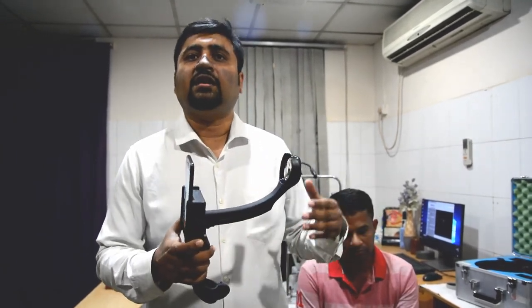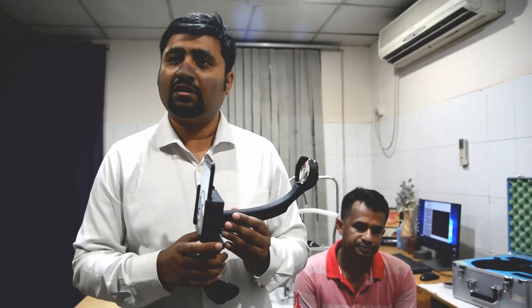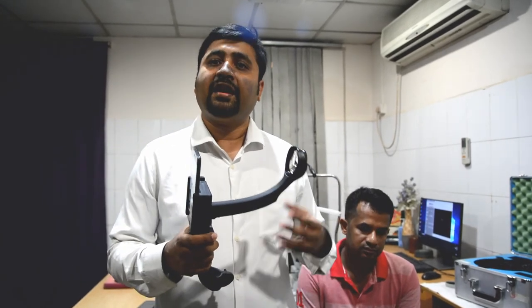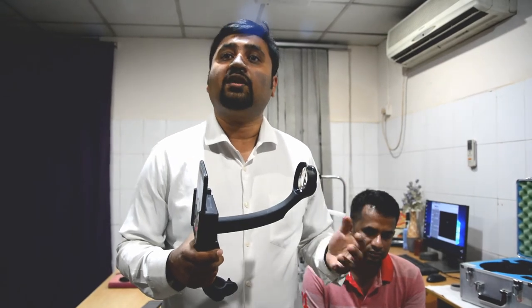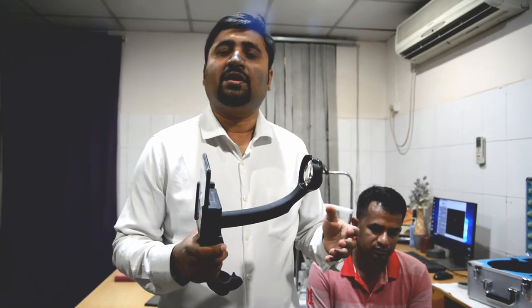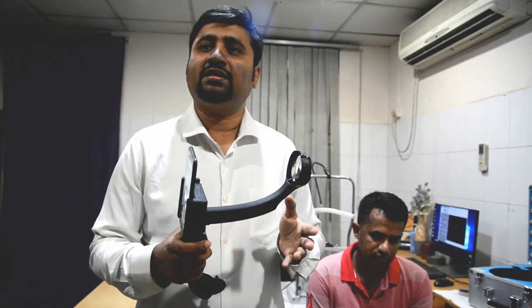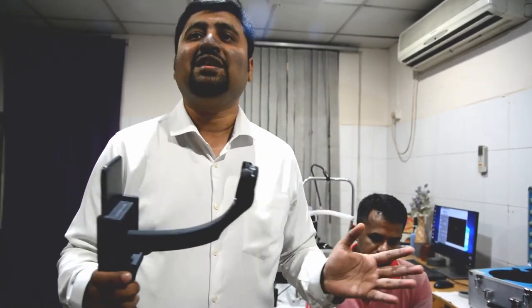How did we say this? We have designed this device to make this device. Ultimately, we have used the device to make this in the community. We have been doing this for a while, and we have also done the job, and we have done that more than anybody else.